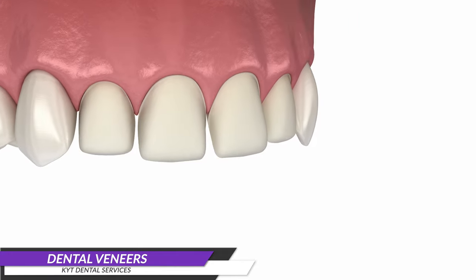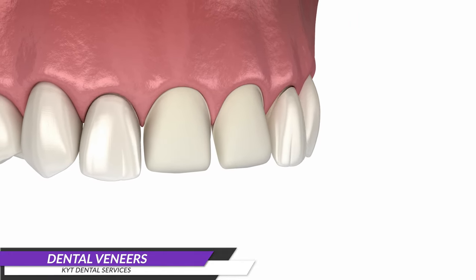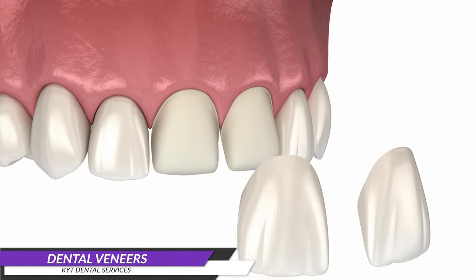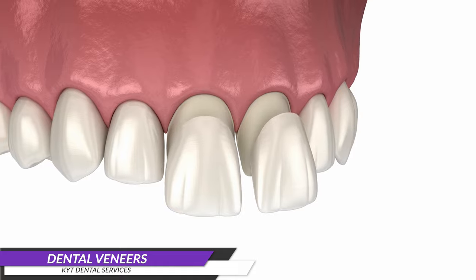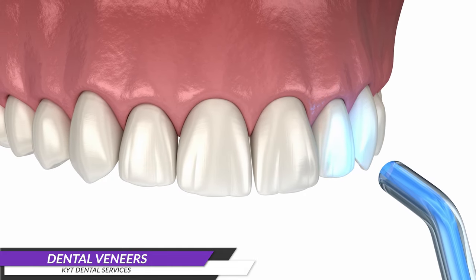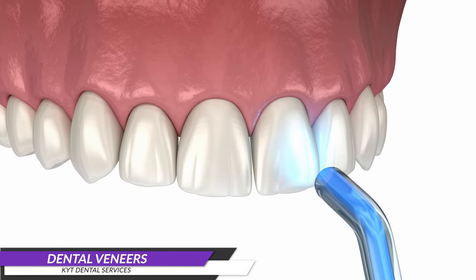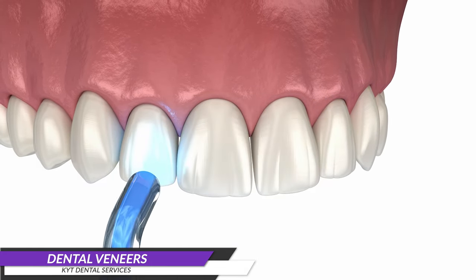Once the patient approves the appearance, the veneers are carefully placed on the tooth surface, ensuring a seamless and long-lasting fit. The veneers are cemented using dual-cure cement for a strong and durable bond.